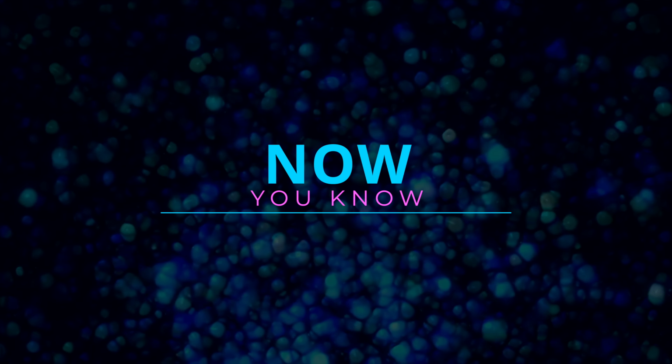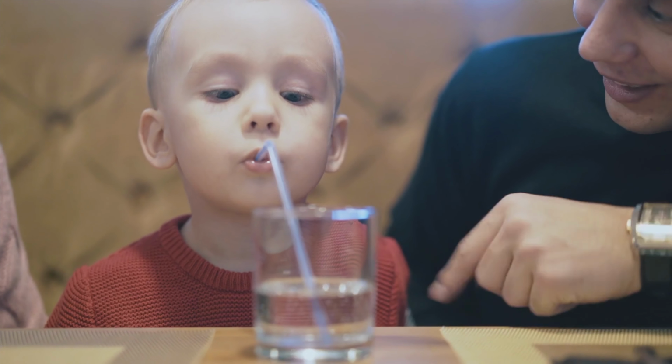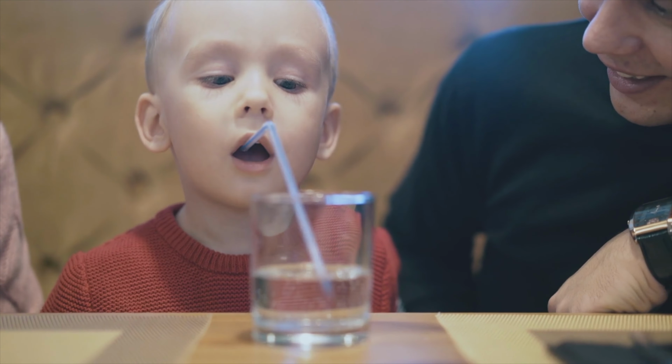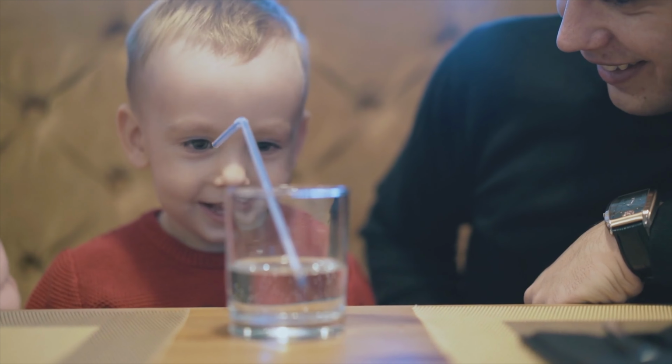That is precisely how we measure pressure and what the centimeters of water pressure means. How can you do this at home with a cup and a straw? The deeper the straw submerges, the greater the pressure to force bubbling.